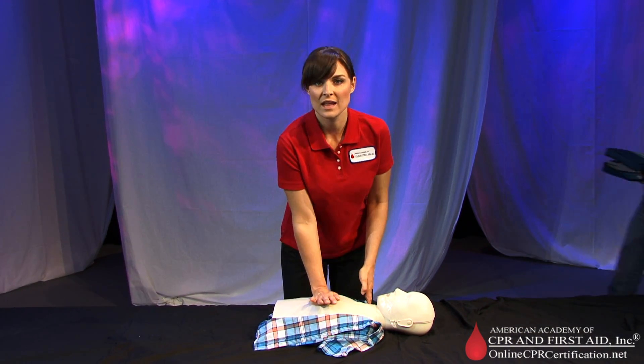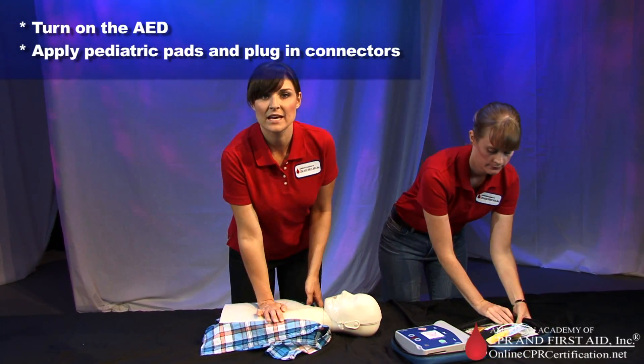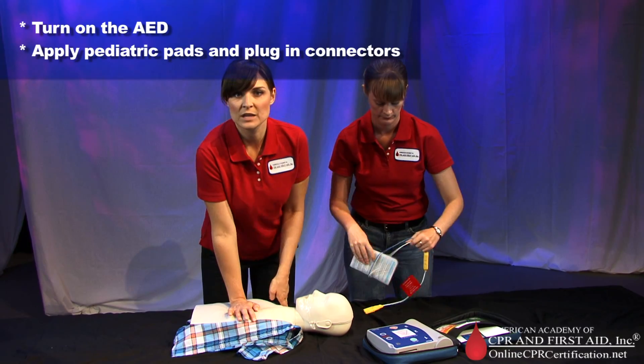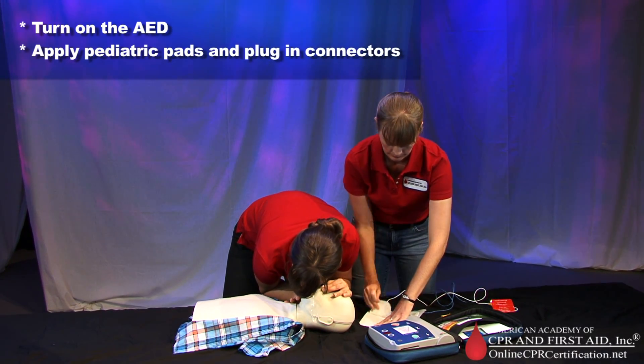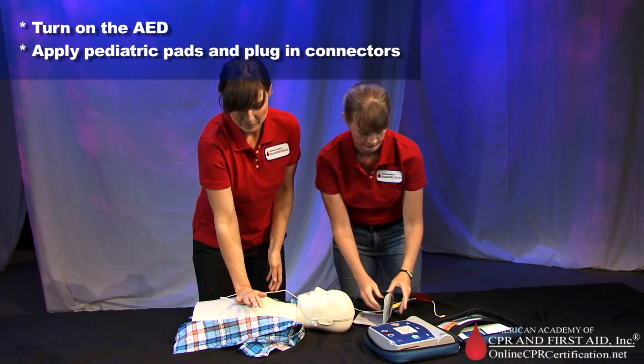When the second rescuer arrives on the scene with the AED, turn on the AED and follow the prompts. Apply pads to the patient's bare chest. Plug in the pads connector next to the flashing light.